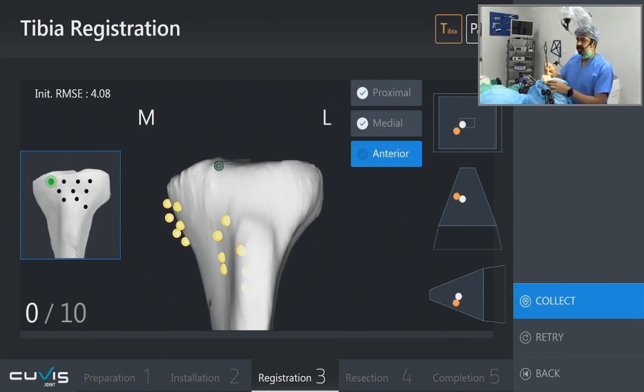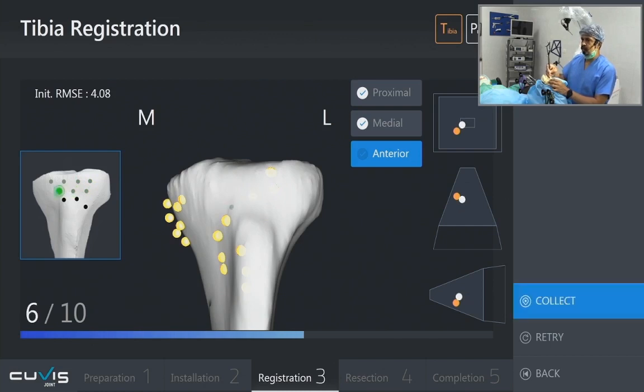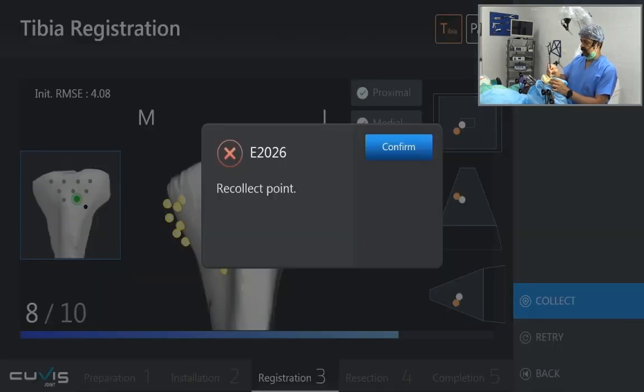And then on the anterior surface of the tibia, medial, then move towards lateral, then again little lateral, and then again quite lateral, then I come little posterior, then go towards medial, then go again towards medial, then come again little posterior. Yeah, here you go.